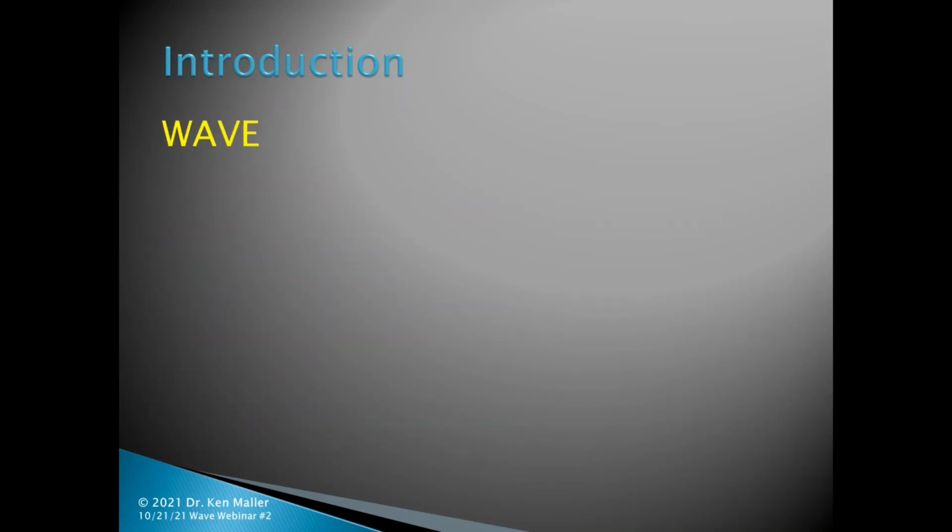All right, so let's get to Wave. What is it? Well, that's a really good question. A lot of people think Wave is a lens. Some people think it's a piece of software. It really is an interface, and that's all it is. It's a software interface that lets a physician talk to a lathe to design what's necessary to be manufactured.